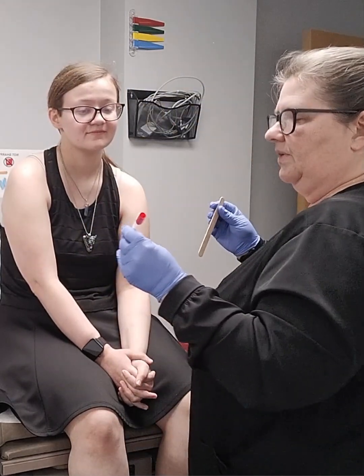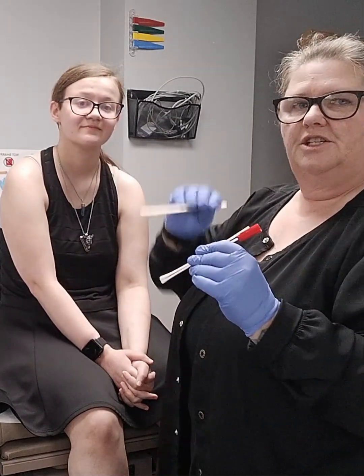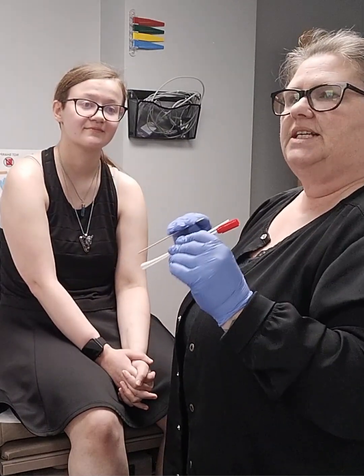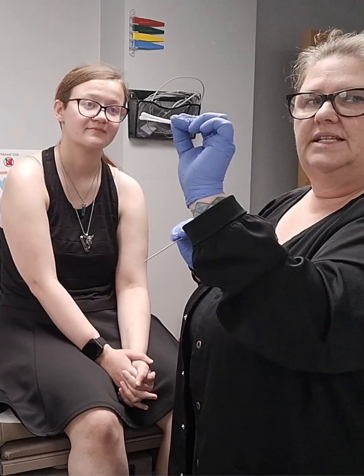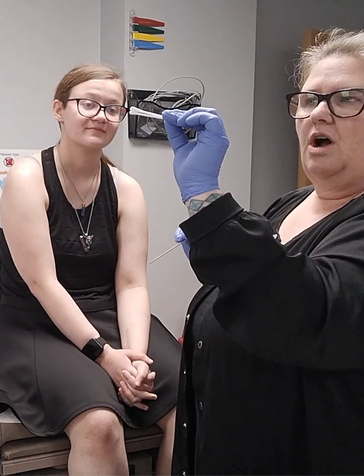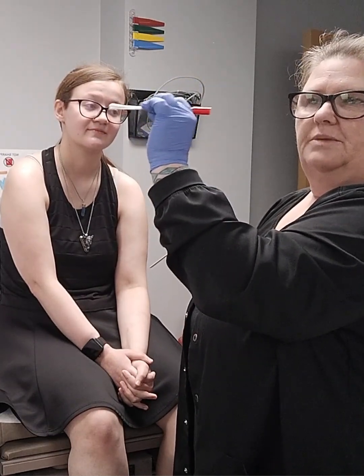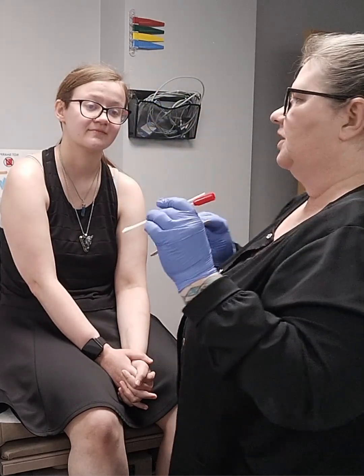So here in a moment, I'm going to do that. Once she has her mouth open, I have the tongue depressor holding her tongue down, and she has said 'ah,' I am going to stick this into the back of her throat and quickly take a little bit of a swab in kind of a figure-eight motion, and another little bit of a swab off of both of her tonsils.